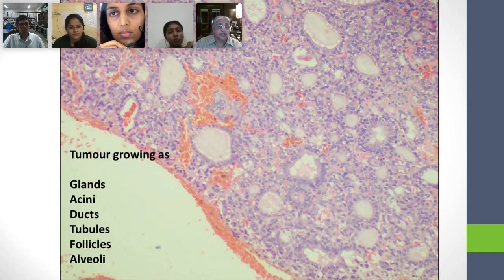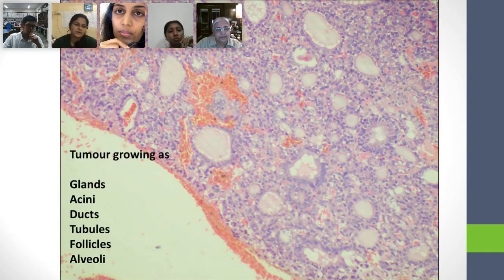Now, we come to the last thing. What's an alveolus? What's an alveolus and where do you find them? It's a surface and cells are clinging along the surface from all sides towards the inside. Where do you normally see alveoli? Lung. Anywhere else?